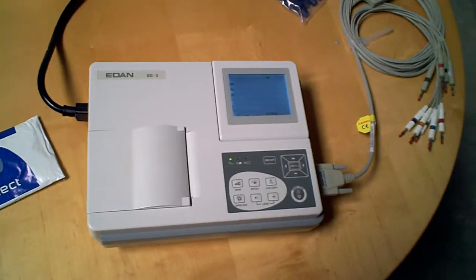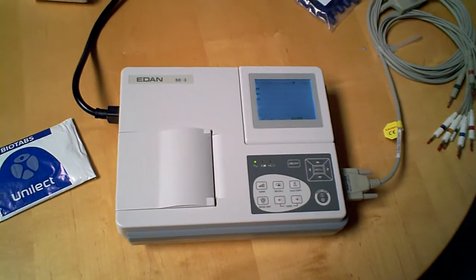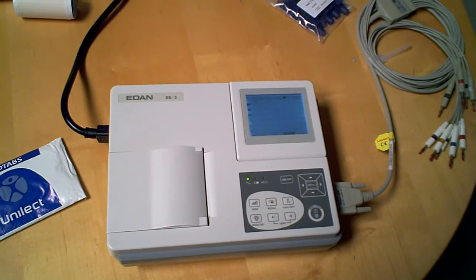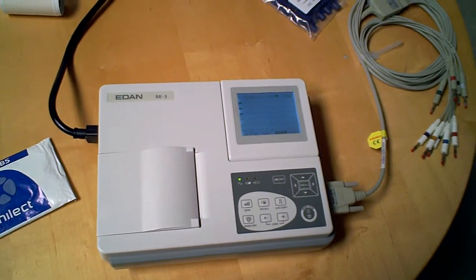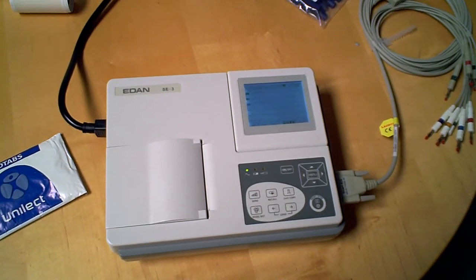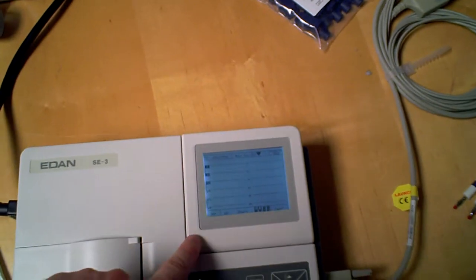Here's a sample of an Edan SE-3 EKG, and this is a three-channel machine. Noticeable differences between this and the 601 series and the 1200 Express are, right off the bat, the size of the screen.